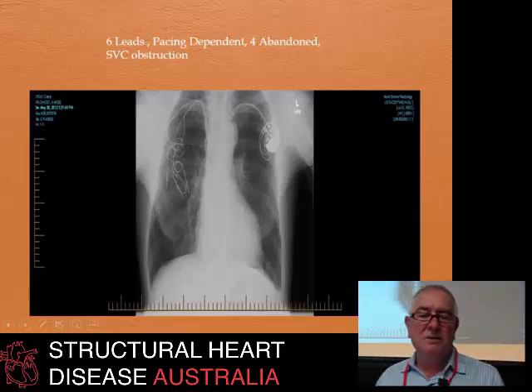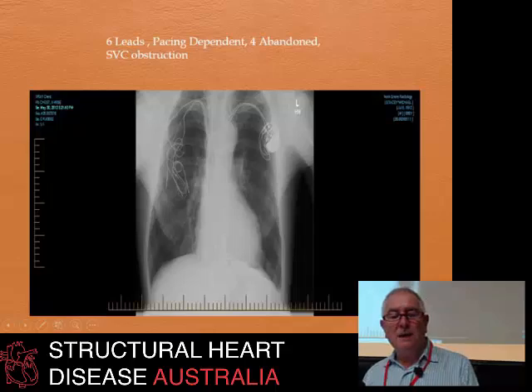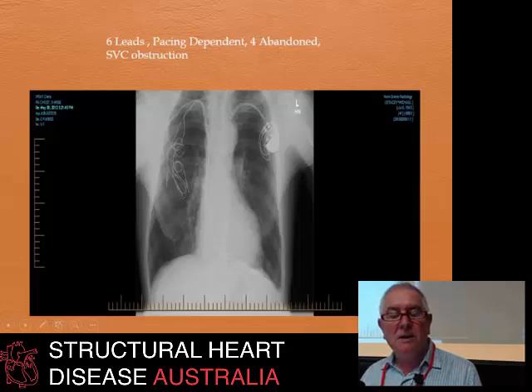This is one of the first patients I ever saw with an SVC obstruction. 4 abandoned leads there, 2 new ones put in over here, you know, someone else's problem. Pacing dependent, severe symptoms of SVC obstruction. Every time he bent over, he nearly passed out. Every morning he woke up, his head was swollen.